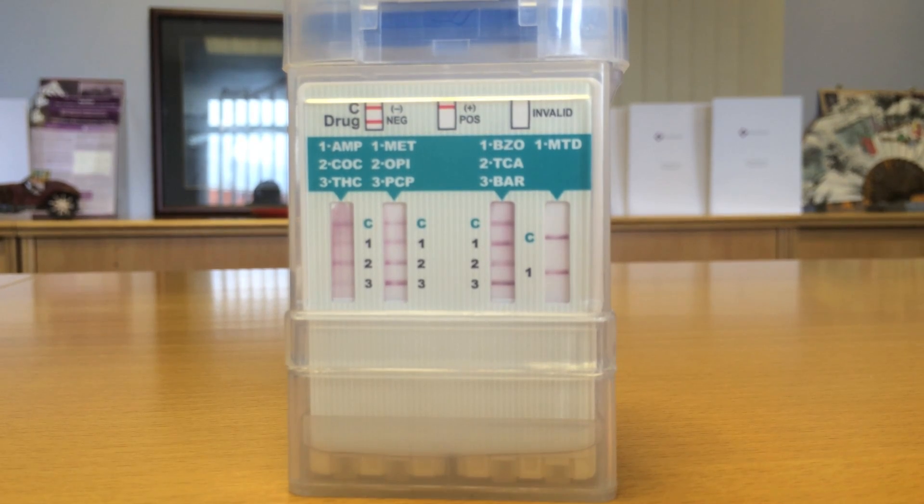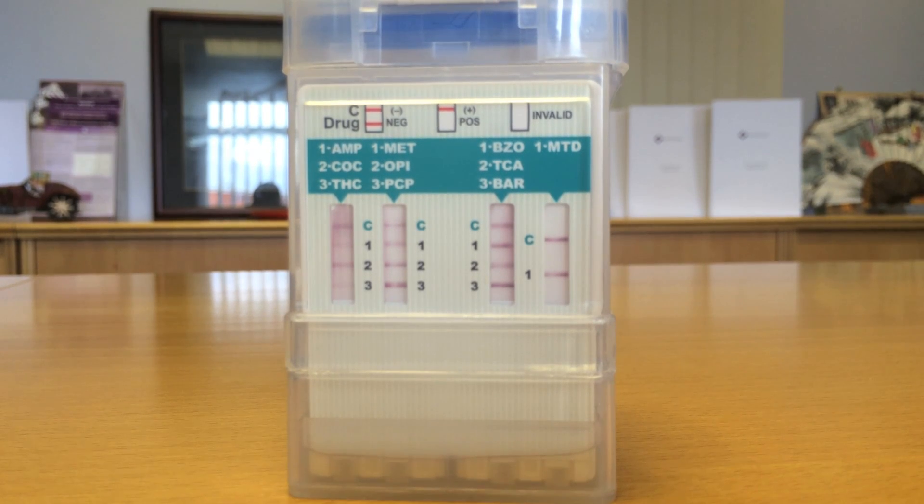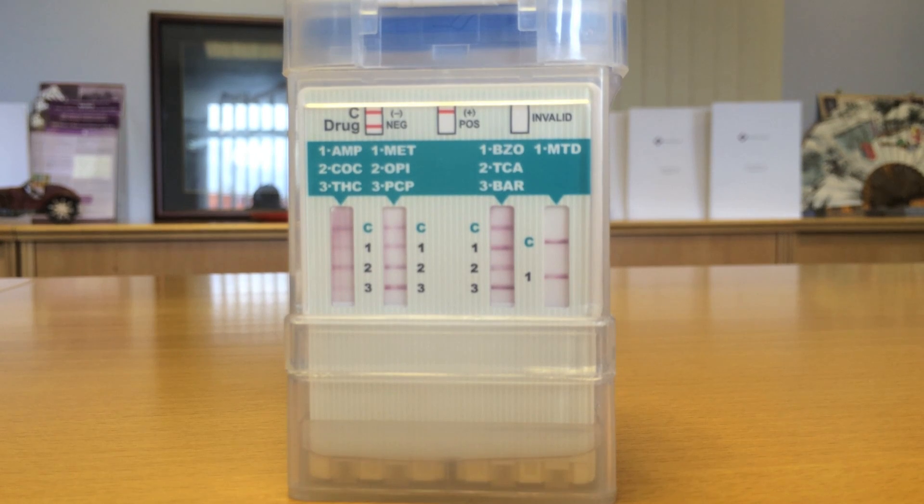Make sure the control line is visible, otherwise the test is void. If the cup is using the built-in adulteration strips, read these results between 3 and 5 minutes.